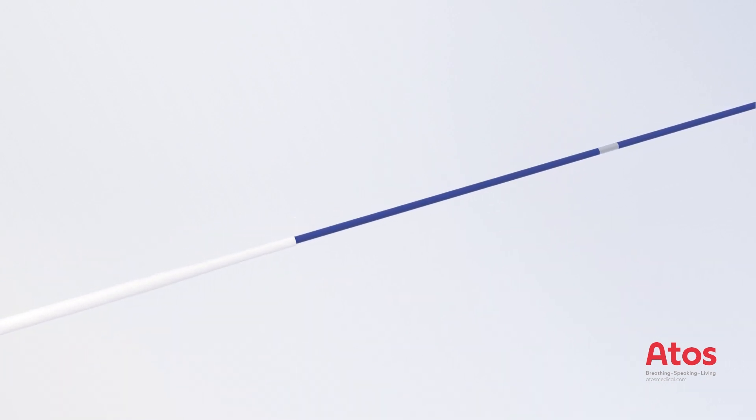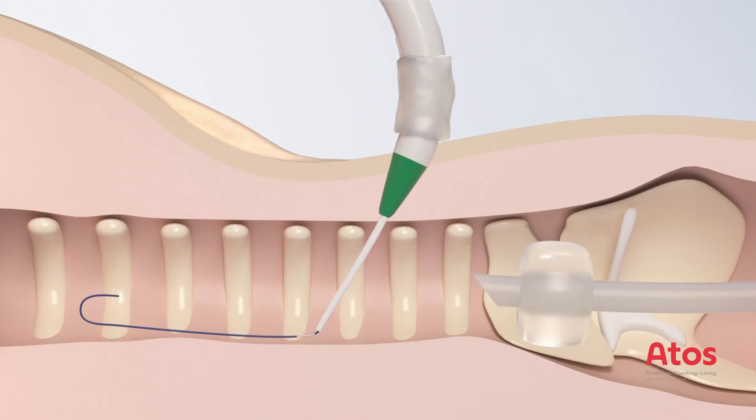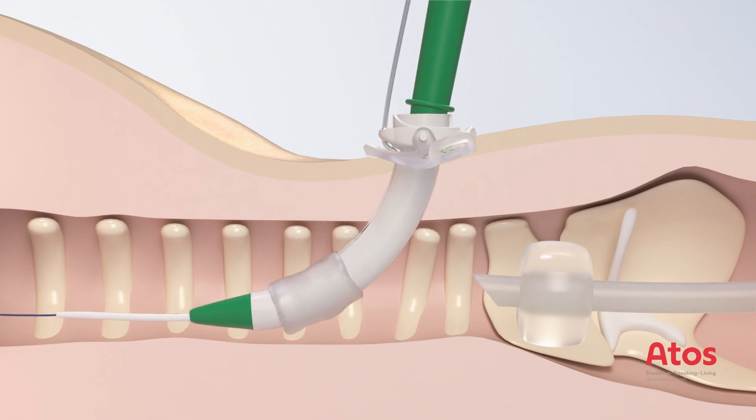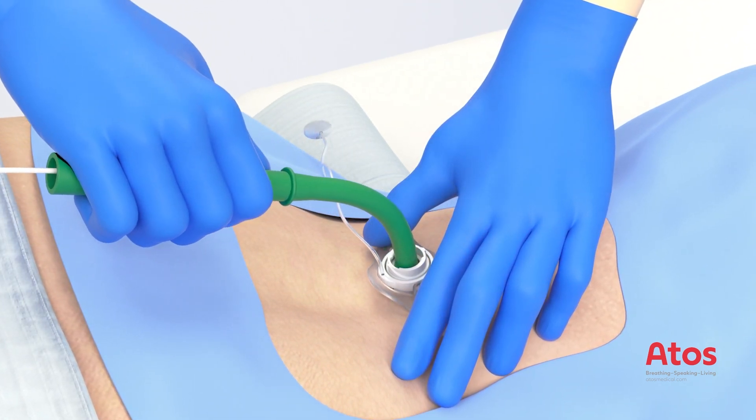Visualize the mark at the end of the guide wire. Start the insertion vertically and place the tube in a controlled movement until the neck flange reaches skin level. Hold the neck flange with two fingers and remove the inserter.